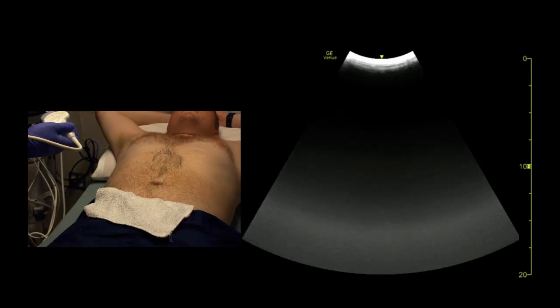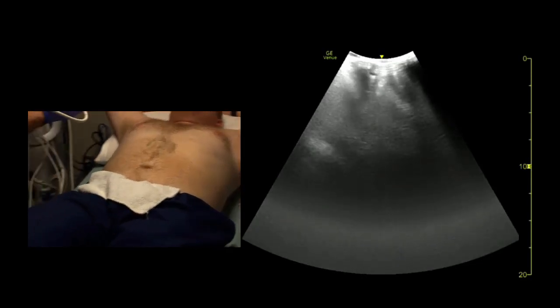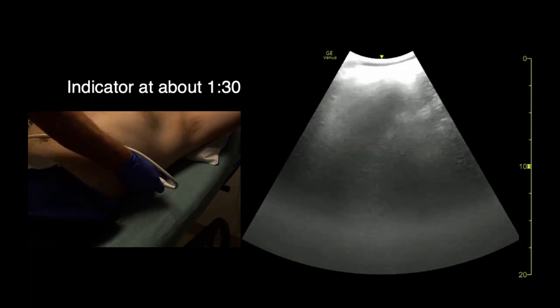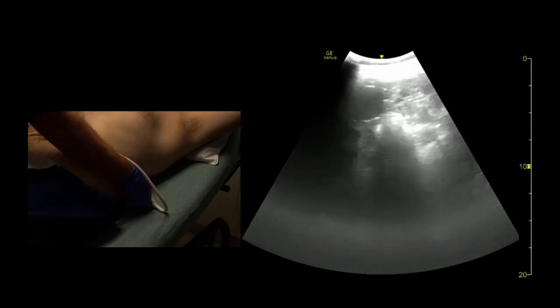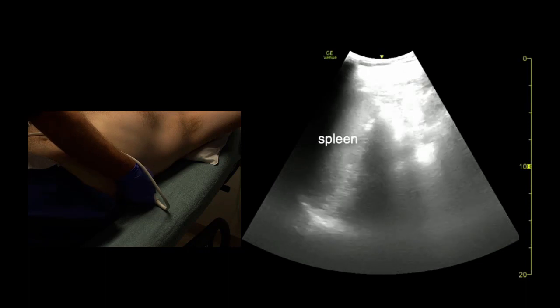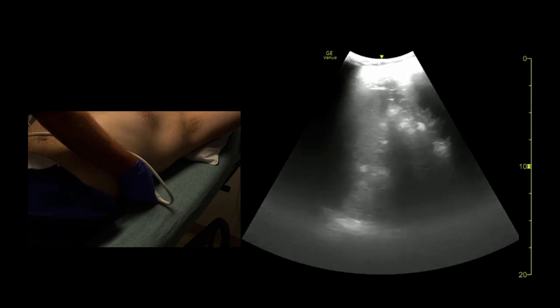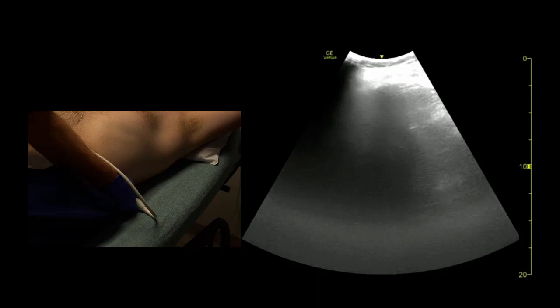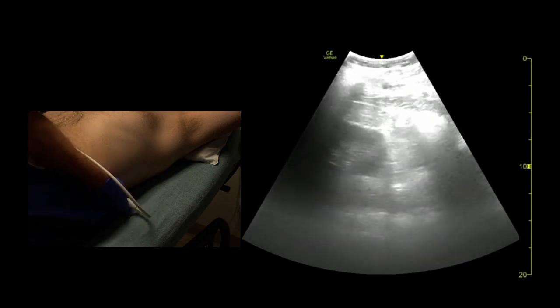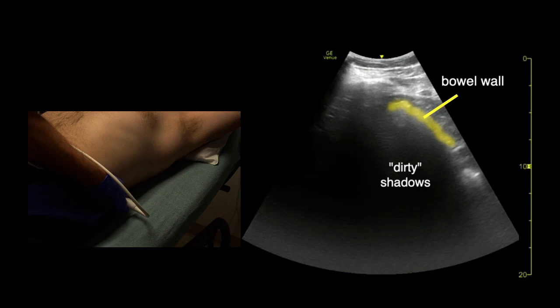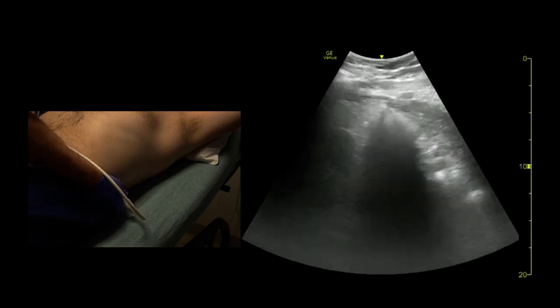Then we repeat on the left side. The only difference on the left is we go a little more towards the patient's head and a little more towards the back. We look above the diaphragm for fluid in the chest, fanning ceiling to floor — there's the kidney, and there's the bowel gas pattern in the paracolic gutter. That's negative on both sides.